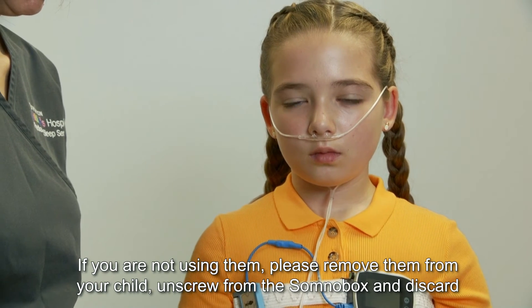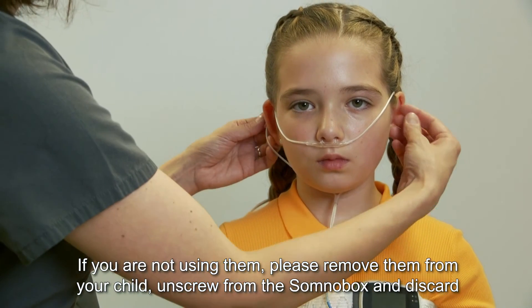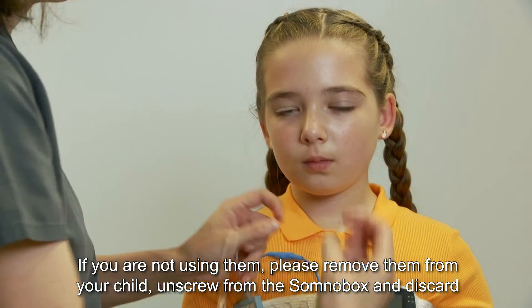If you are not using the nasal prongs, please remove them from your child, unscrew them from the SomnoTouch box, and discard.